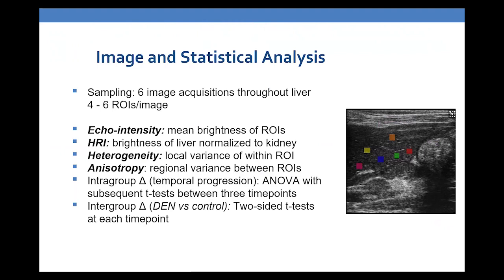Okay. And I think the HRI index is used clinically now for staging steatosis. Oh, I see. Okay. Yeah, I didn't realize that.